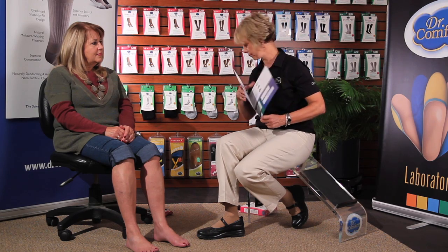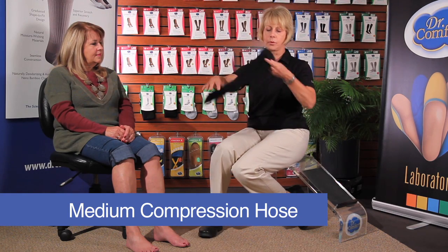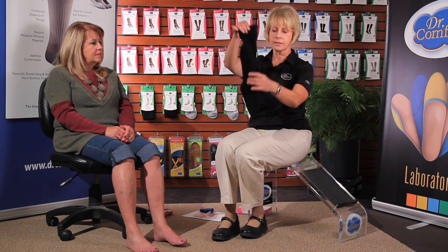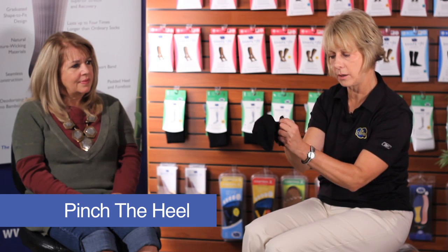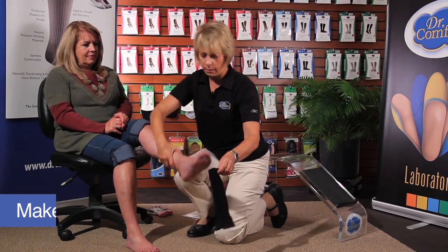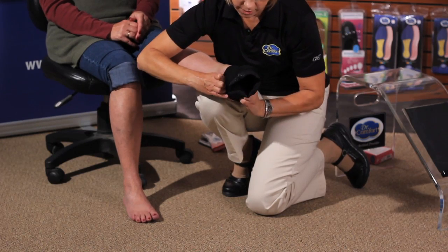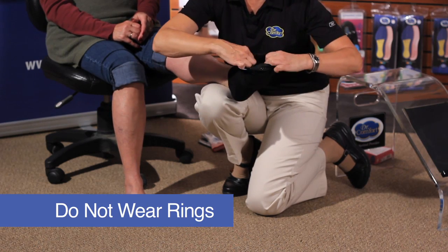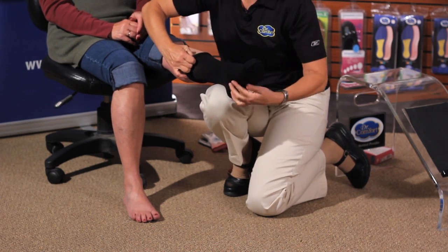So we have a medium compression hose for Kathleen, and I'm going to don that for her. You take the stocking, put your hand inside, take your thumb and forefinger, and press the heel together. Continue to hold that heel while you turn the stocking inside out. You make a pocket for the foot, then continue to don over the foot and pull it over the heel. It is best not to wear jewelry or rings when donning a graduated compression hose because they can snag, run, or pull.